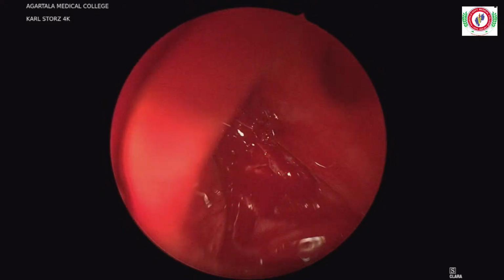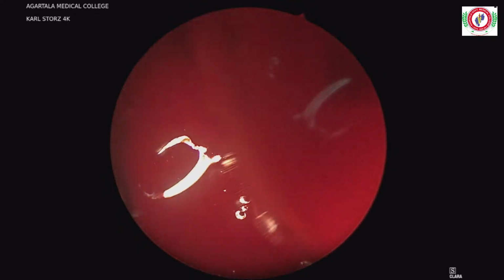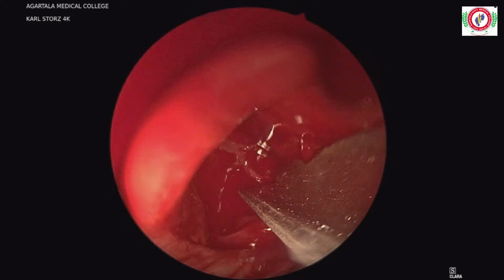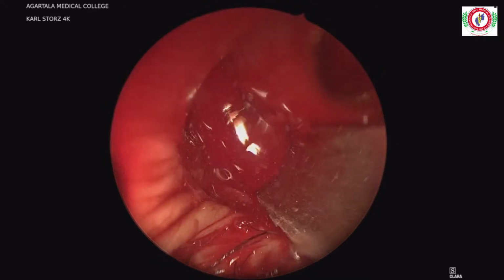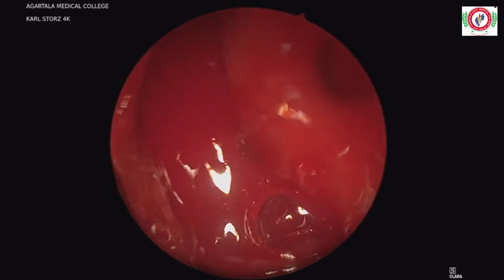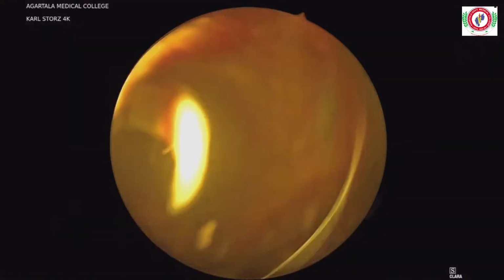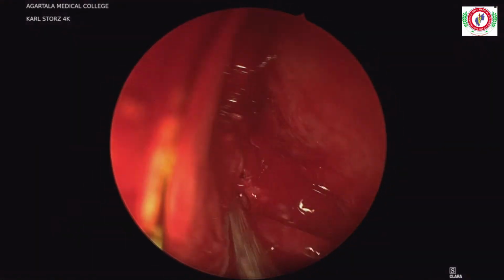So I am raising the flap on the opposite side from the spur now. So this is a very anterior spur, right? So yes. So now give me chisel hammer. For the interest of the audience, when we come across spurs or bleeding at the spur area, how do you advise them to control the bleeding?